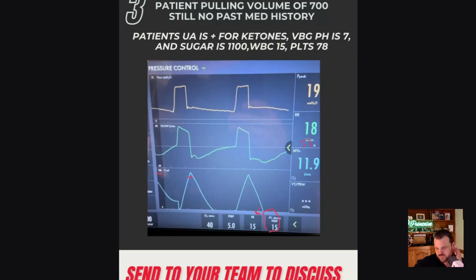Whether they're triggering every breath or not, they are breathing at this point. So if we would say the driving pressure is 15, that would probably be false. It would be false because even at end inspiration, the flow hasn't gone down. Now, is that because the patient has emphysema and their compliance is really great? That could be possible. Is it because the patient is participating in breathing, so they're dropping their diaphragm and creating more negative pressure from the bottom, so they're getting more flow and volume? That could also be possible.